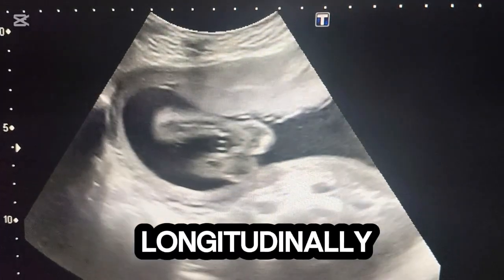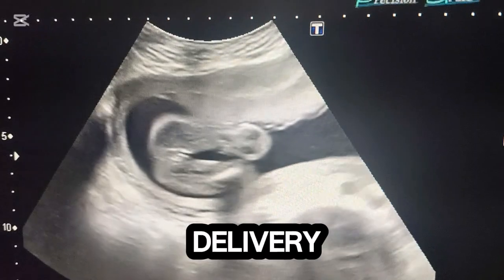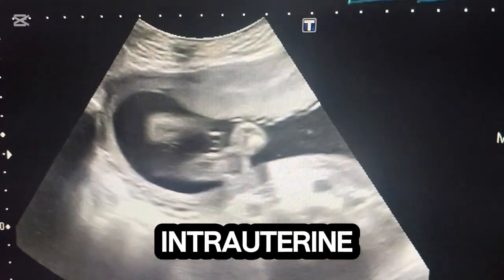Fetus lies longitudinally with head presenting downwards in cephalic position, optimal for vaginal delivery and indicating normal intrauterine orientation.